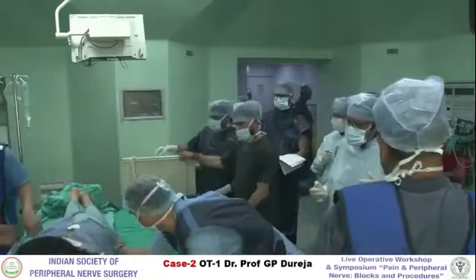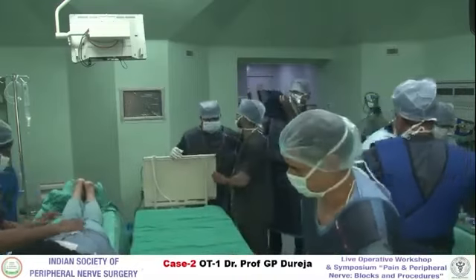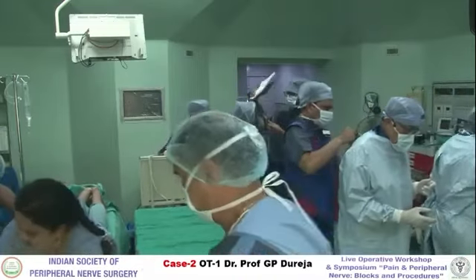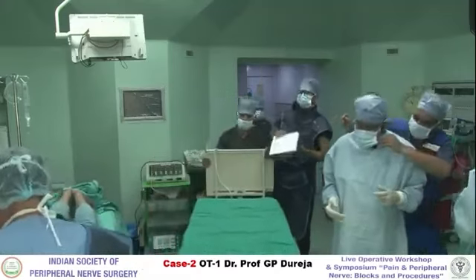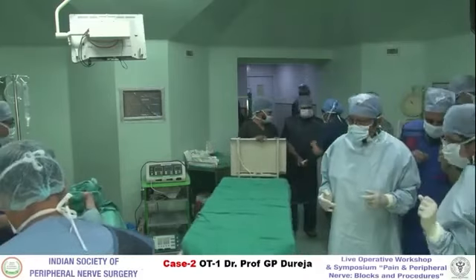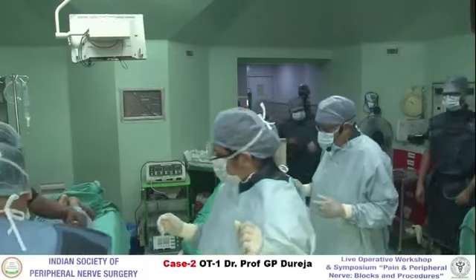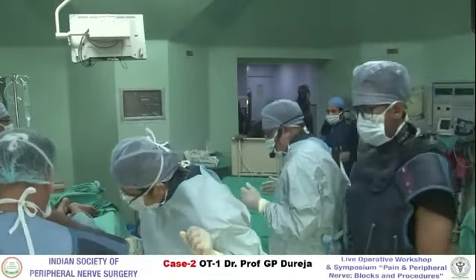Another question is what should be the acceptable impedance in RF medial branch block? It was around 400 to 500 in trigeminal. Is there any such guideline for RF medial branch block? Up to 700. Because there we are near the bone, so the higher impedance is acceptable.